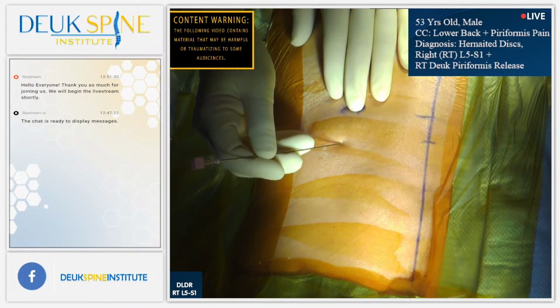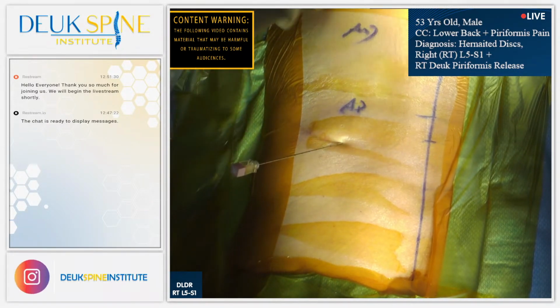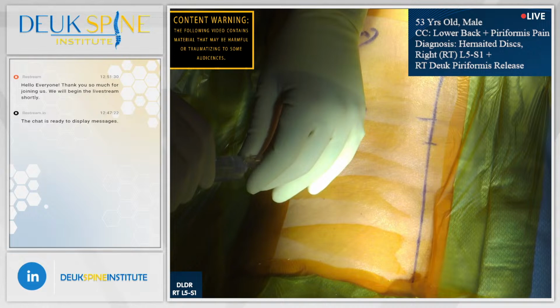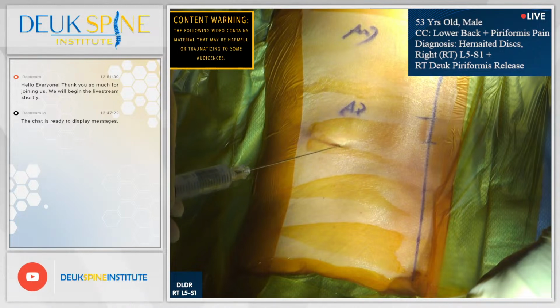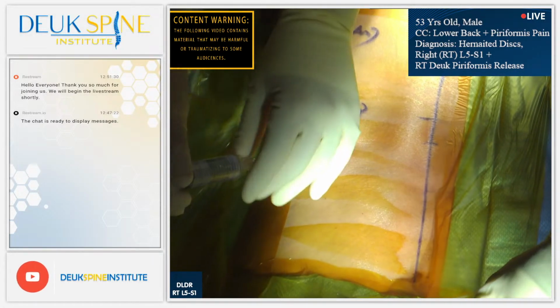That's right. Luis has exposed a little more than we normally would at 5-1 because we're fixing the piriformis muscle next. That will be a separate stream right after we're done with this disc. He has piriformis syndrome. We'll talk about that later. Our viewers can ask questions if they want.